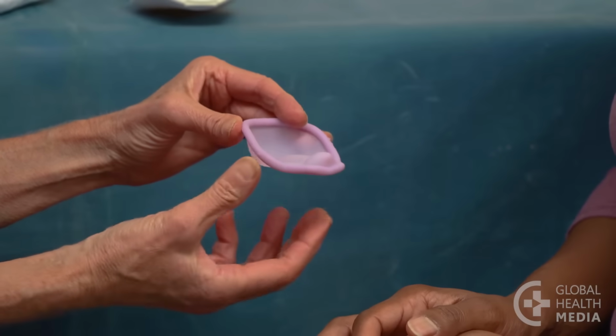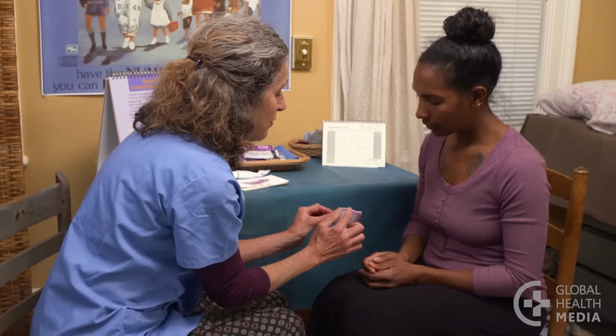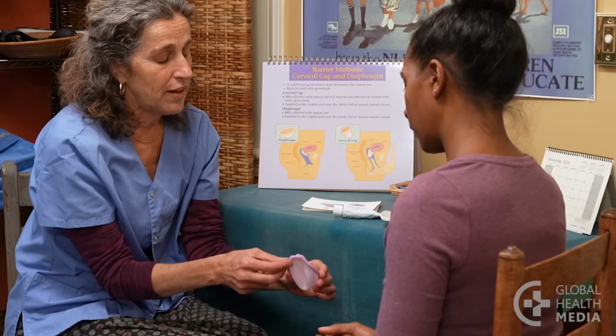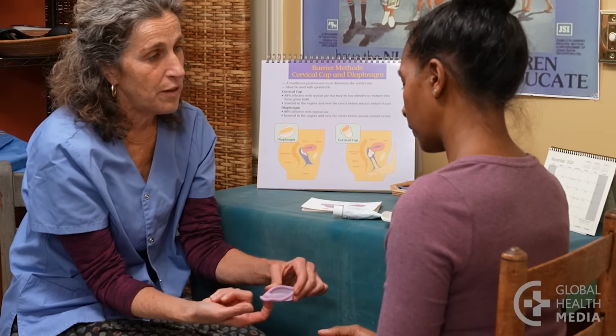There are little bumps on each side to help grip the diaphragm. Squeeze it together to insert it, putting the rounded rim in first. This little indentation fits your fingertip and makes it easy to pull the diaphragm out.